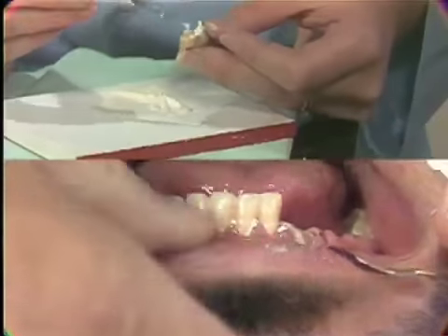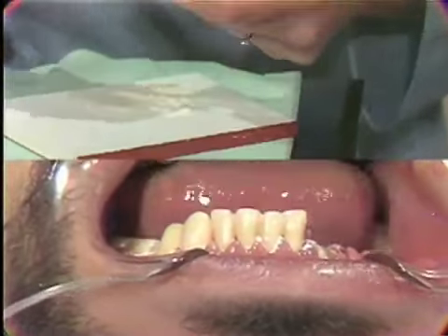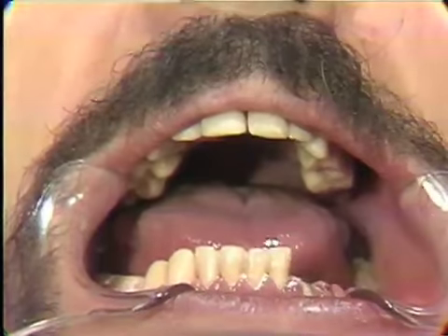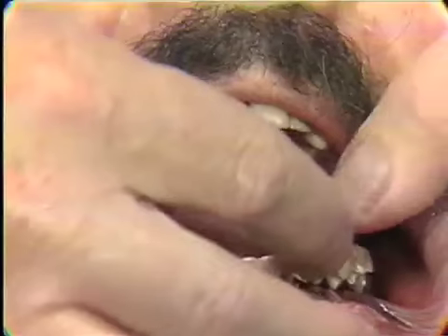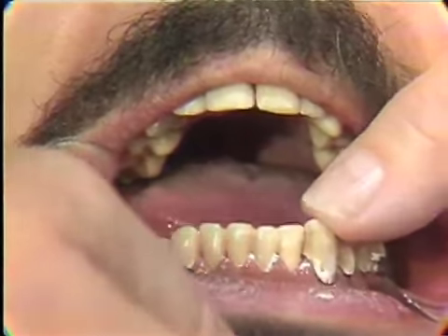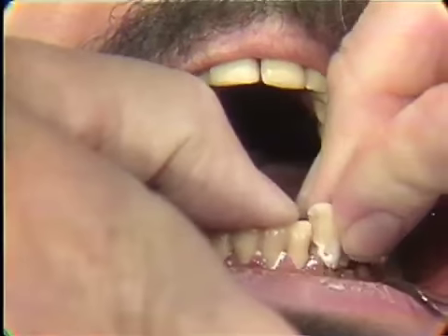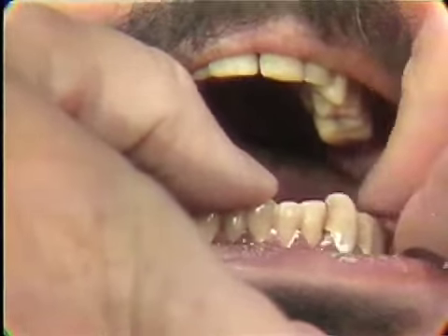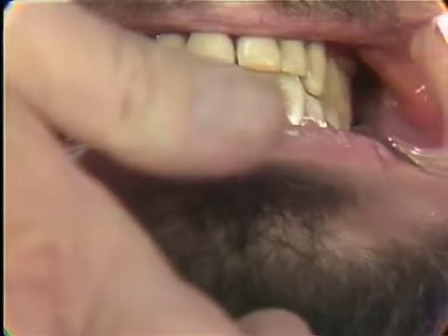I don't think in the period of time that we're talking about you would create any problems with decay, but you sure could have a sensitive tooth. Okay, close, tap, tap, right down.